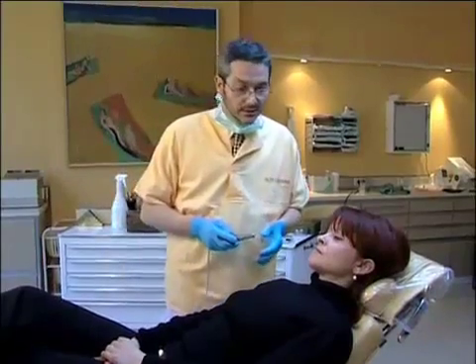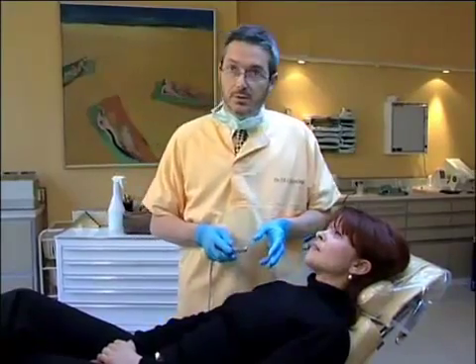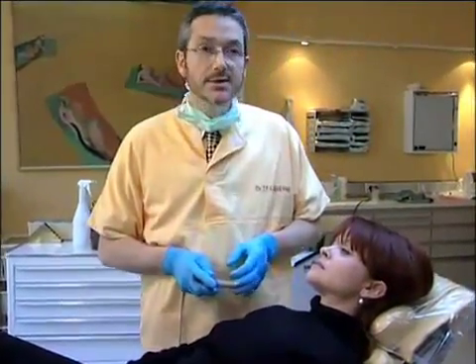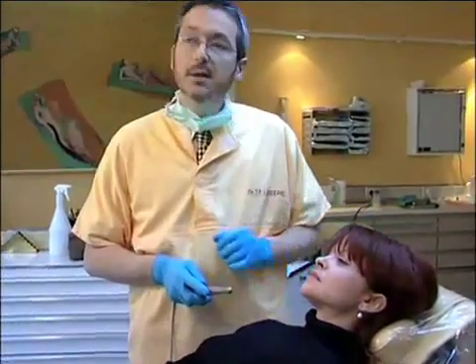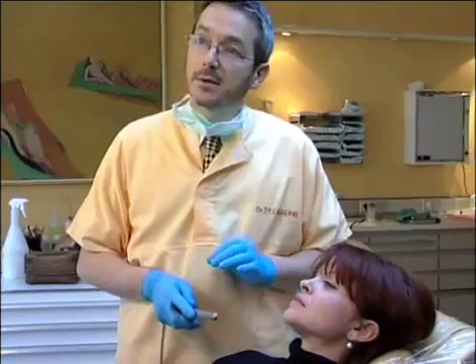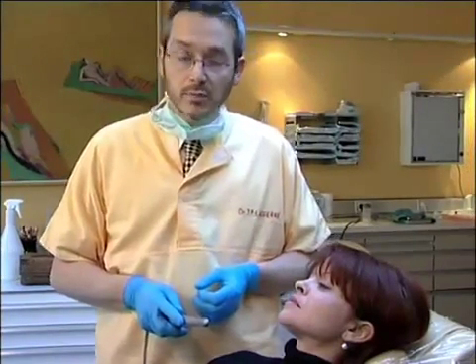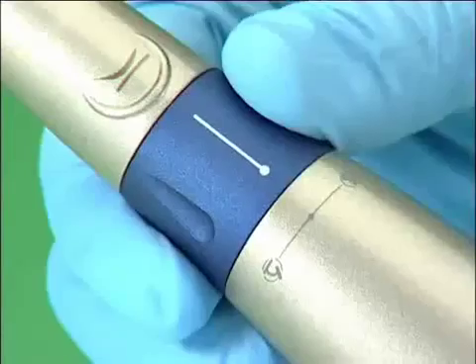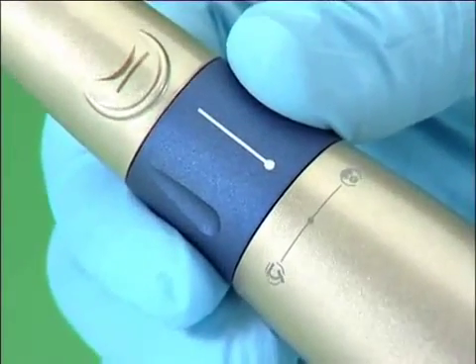We are going to complete the base tooth tint picture with general shots, i.e. facial shots and global tooth shots, allowing for better communication with the prosthesis lab. The camera is then placed on the extraoral setting ring and pictures are taken.